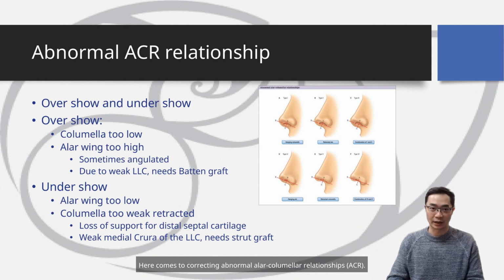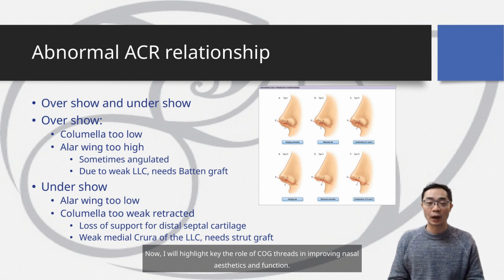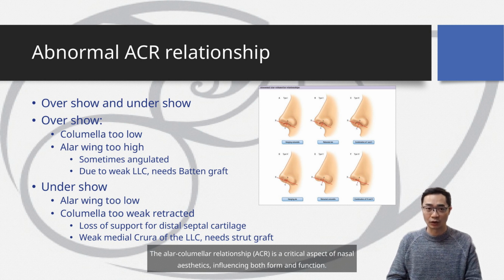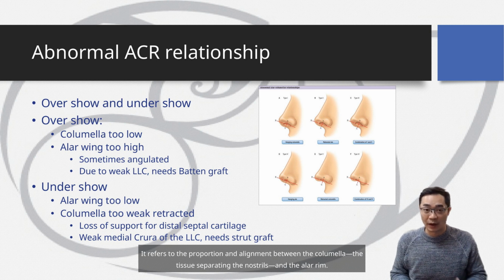Here comes to correcting abnormal alar-columella relationships, ACR. Now, I will highlight the role of COG threads in improving nasal aesthetics and function. The alar-columella relationship, ACR, is a critical aspect of nasal aesthetics, influencing both form and function.